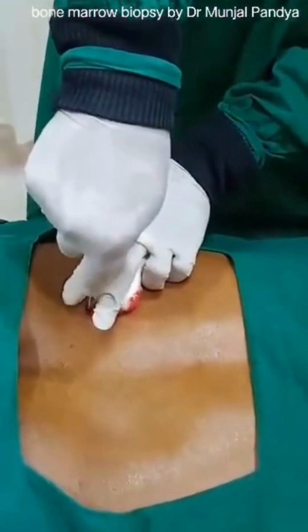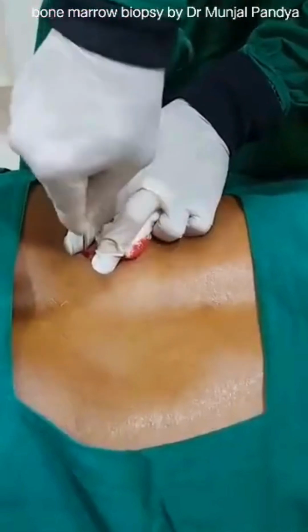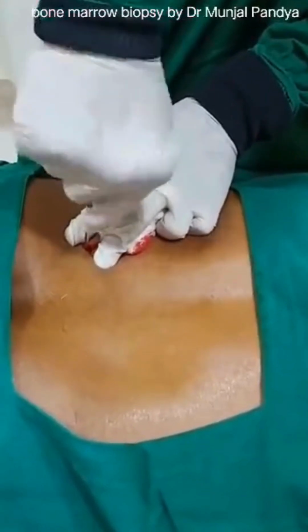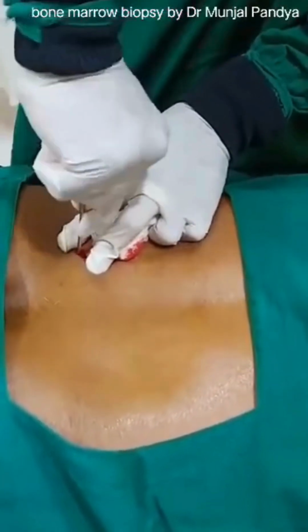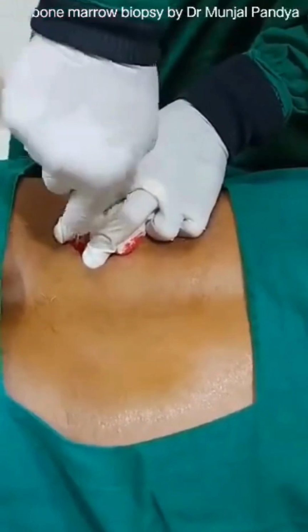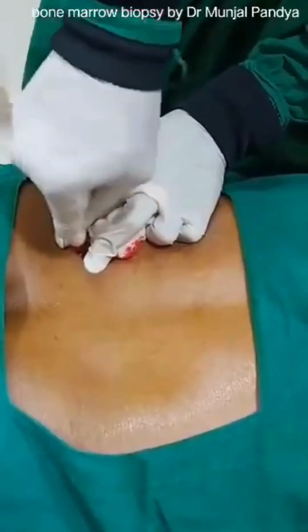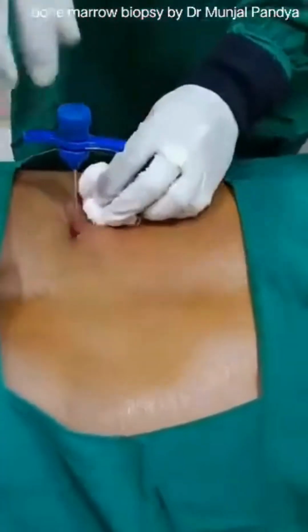So you can observe my wrist movement and bone marrow needle. I am going into the bone gradually, and once you get into the bone, you get the firm feel that okay, it is in the bone marrow. You have to take extra care just to avoid the bleeding, because this patient, as I told you, has a 7,000 platelet count. So now I am almost in.